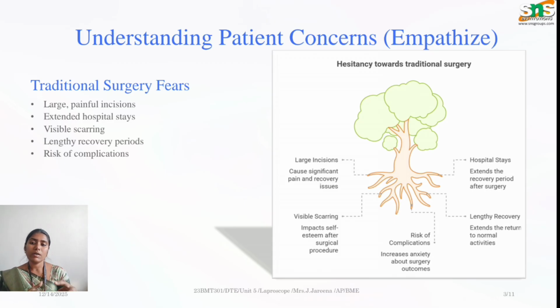But the concept is the same: the endoscope is also used to visualize the internal organs, and the laparoscope is also used the same way. The point of access is different between endoscope and laparoscope. So now we will be discussing the empathy perspective of this laparoscope.